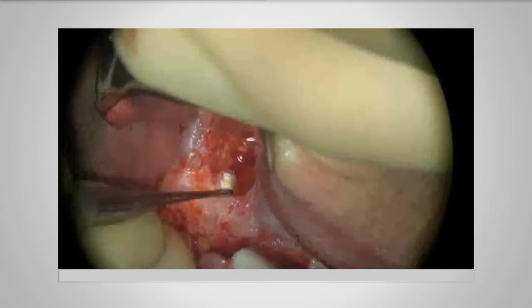And that's the completed root end filling. You can see the IRM goes all the way down to the post. It's a nice conservative preparation. We haven't removed loads of dentine, but we've managed to clean right down to the tip of the post. And that's modern microsurgical endodontics.